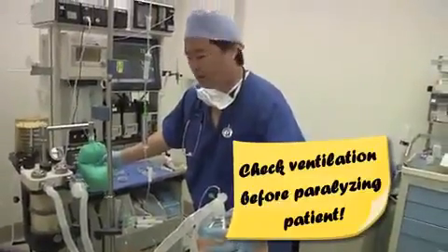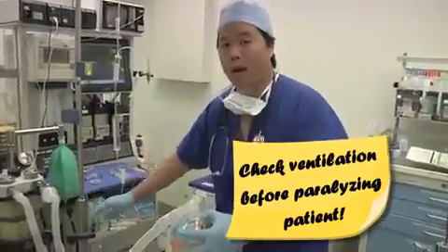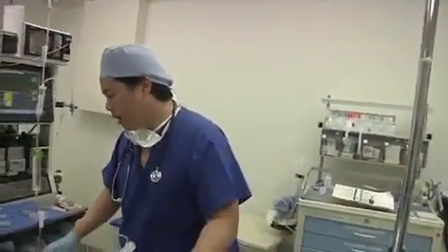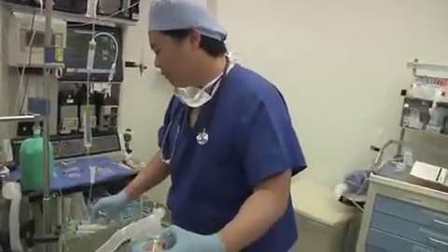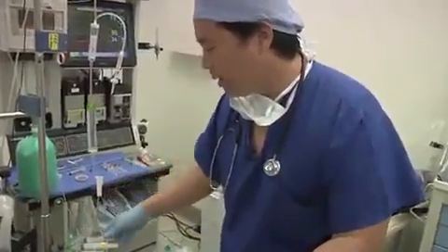And we always like to check this before we administer the neuromuscular blocking agent. Obviously, if you had some difficulty with ventilation, then you would probably defer administering a neuromuscular blocking agent until you could definitively establish that you could ventilate the patient. So I've administered the vecuronium.